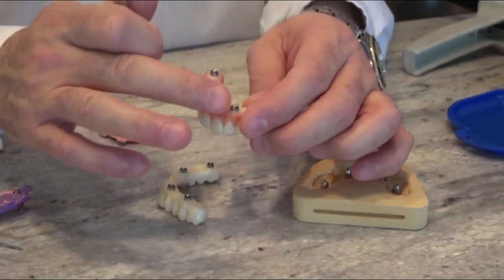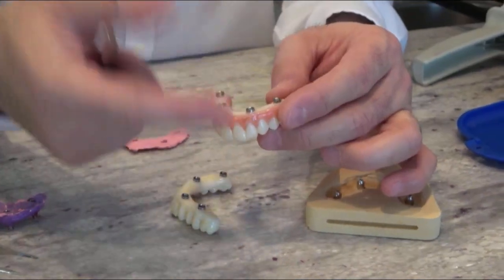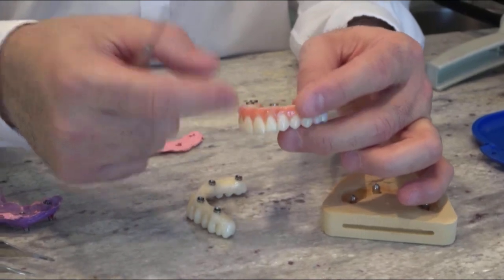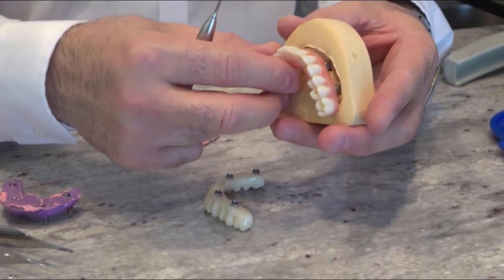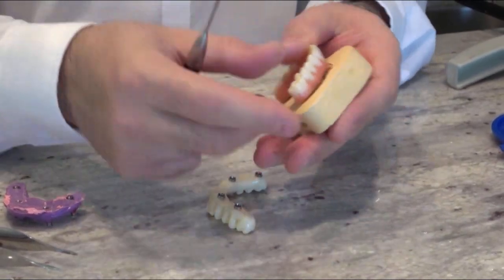So what you do, you just add composite here, condition the soft tissue, and once that's okay and it's cleansable, put it on the model like this.